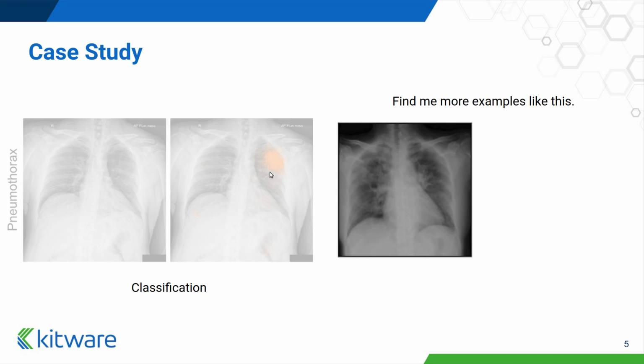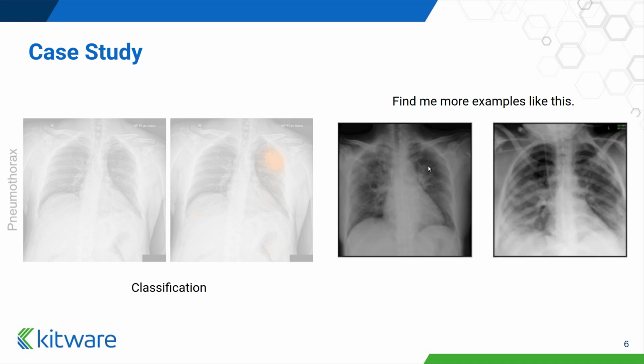In contrast to image classification, our work explores explainable image retrieval. Here, the model aims to retrieve similar images from a large archive given only a single query image, such as the one shown on the left. The retrieved images can facilitate case-based reasoning and the discovery of underlying patterns in the data. We can also use similarity-based saliency maps to reveal parts of the retrieved images that match the query image and were used by the model during the retrieval process.